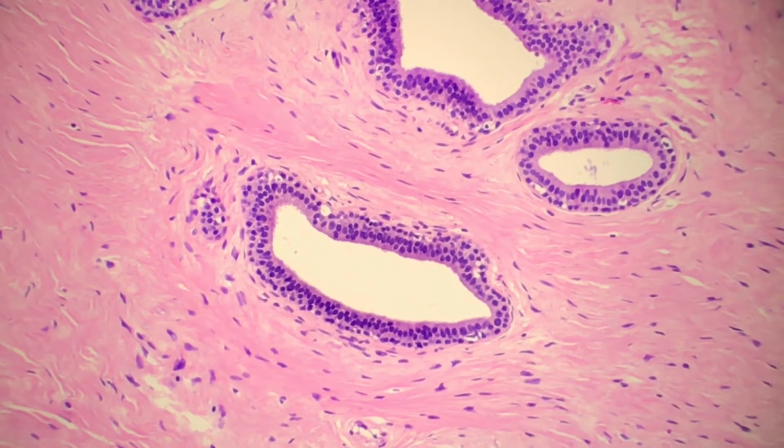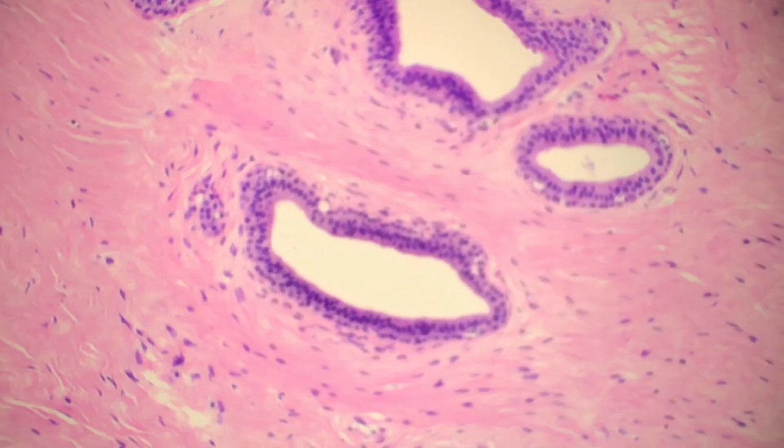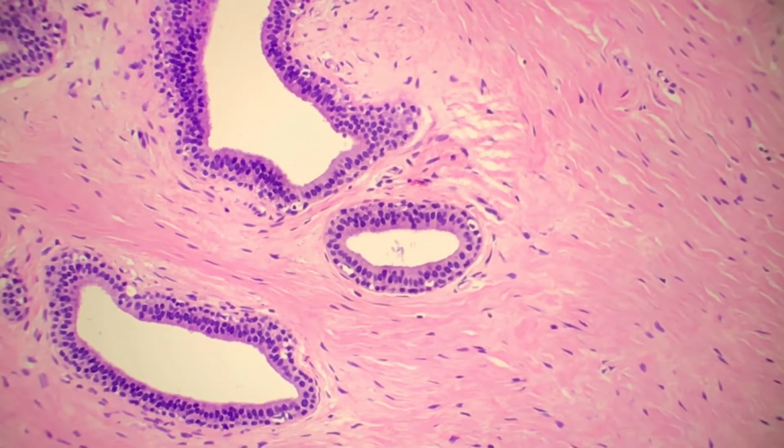If we move on to the epithelial component or the glandular component, this is a pretty good area to show you that. So what we have with it is you either have cuboidal or columnar epithelium. And maybe if I go to this little gland up here. So the little gland that I now have centered, I think shows it a little better. We have very bland columnar epithelium. Now, even though it's bland, in the breast, you don't want everybody to look exactly the same. So you notice that there's some slight variations in size, in shape, but they generally look like, hey, they all belong within the columnar epithelial family. And what's really nice about this gland is that you can really appreciate that secondary level that's underneath the columnar epithelium, and this is your myoepithelium.